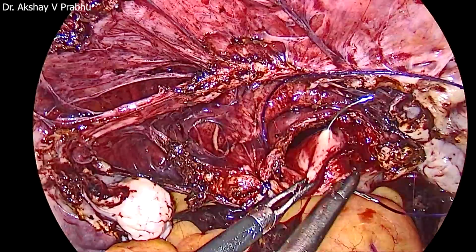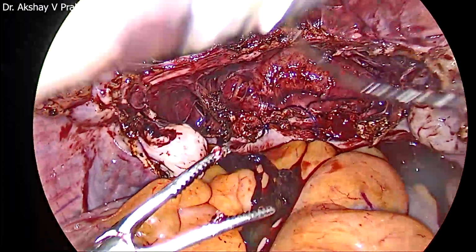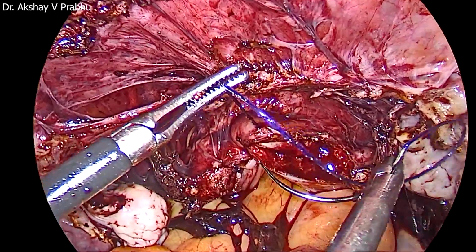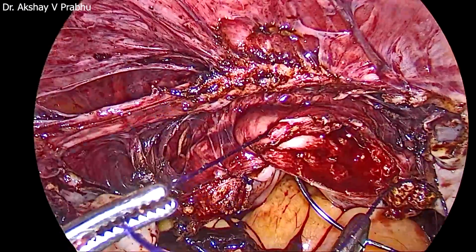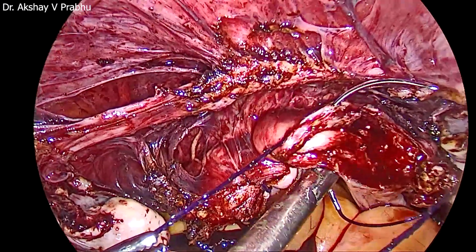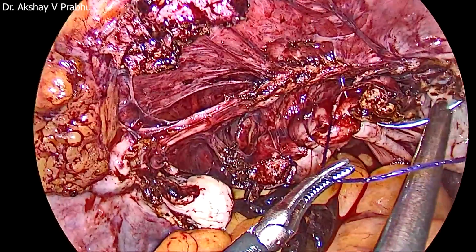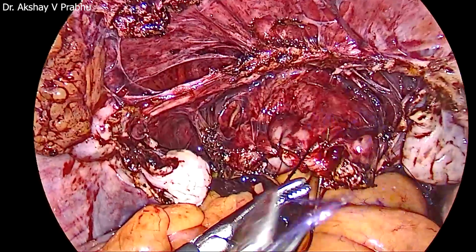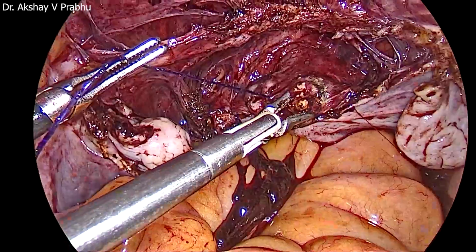Make sure to include the peritoneum and the vaginal end, both. Otherwise, if you miss out either of those, then that end can get inverted and there might be bleeding internally or externally. So make sure that you get the peritoneal end posteriorly and both vaginal ends, so that all microbleeders or oozers will be taken care of.